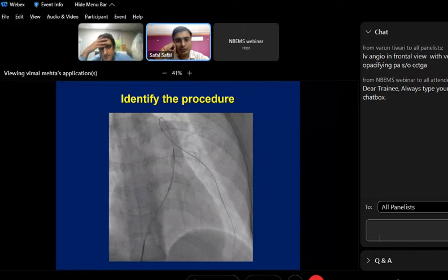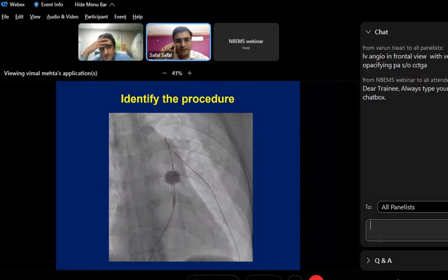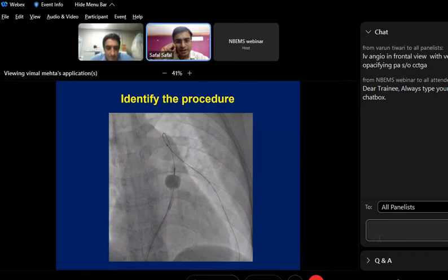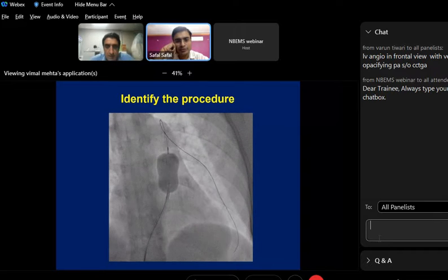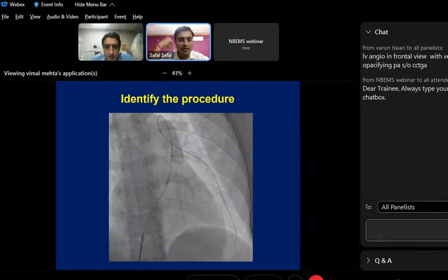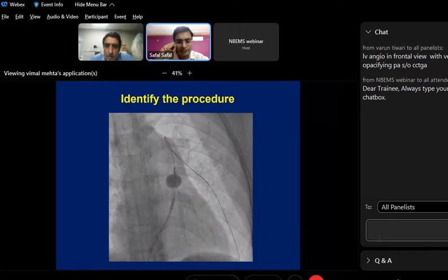Taishak, the whole balloon will open up, leaving just the waist. It will not open up sequentially. This is a classic BMV balloon. So this is the classic character. This will open up, and then the waist. That is what the BMV balloon is made for. So this is BPV using a BMV.